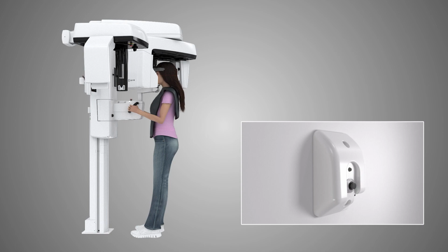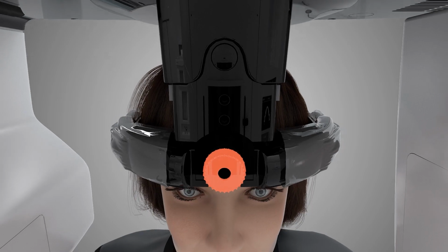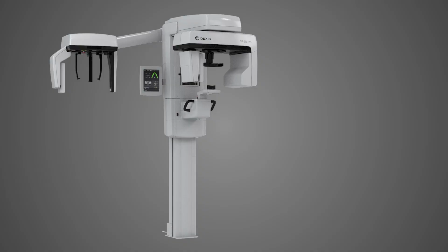Release the exposure button, release the temple support using the adjustment knob, and carefully guide the patient out of the unit. Review the image preview displayed on the unit touchscreen. Remove all disposable covers and disinfect the unit according to the directions in the user manual.